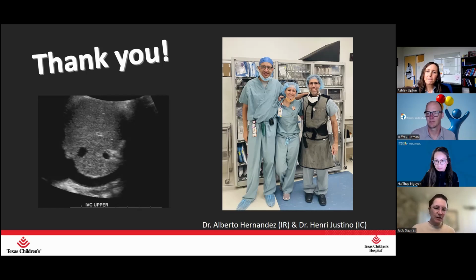We combine those tests for trending purposes over time. We don't do any spleen elastography yet, mostly because I don't know what to do with those values. I think trending over time could be helpful, but our clinicians also look at platelet count, et cetera, and spleen size. So I'm going to wait until I have some more data before we start to do that one.